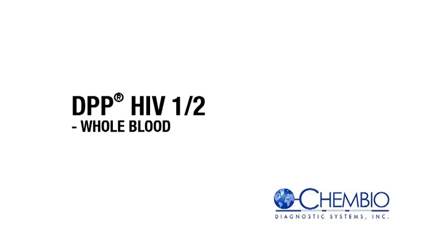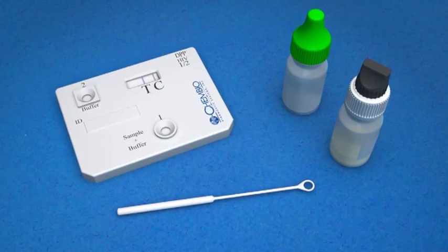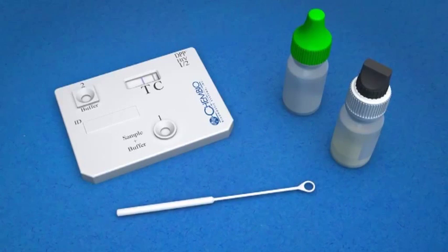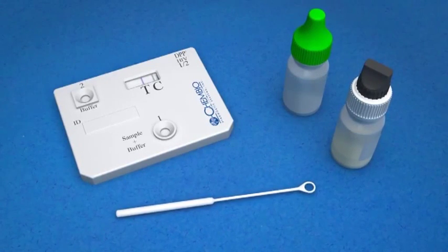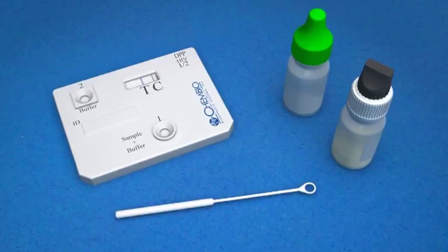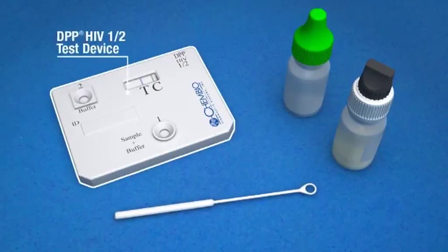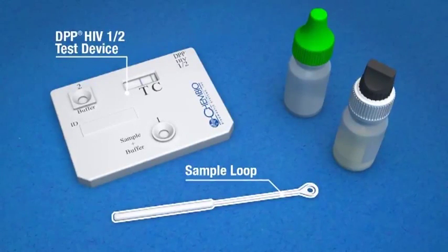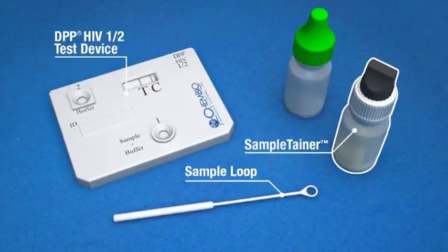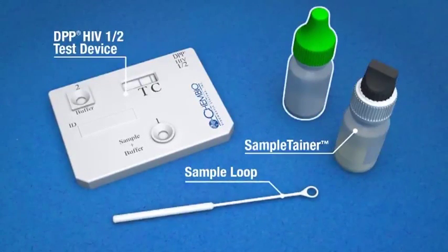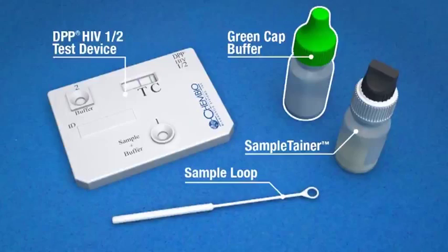DPP-HIV-1 and 2 instructions for whole blood dilution method. The assay for whole blood contains the following components: the DPP test device, the whole blood sample loop, a black cap sample tainer for diluting specimens, and a green cap running buffer bottle.